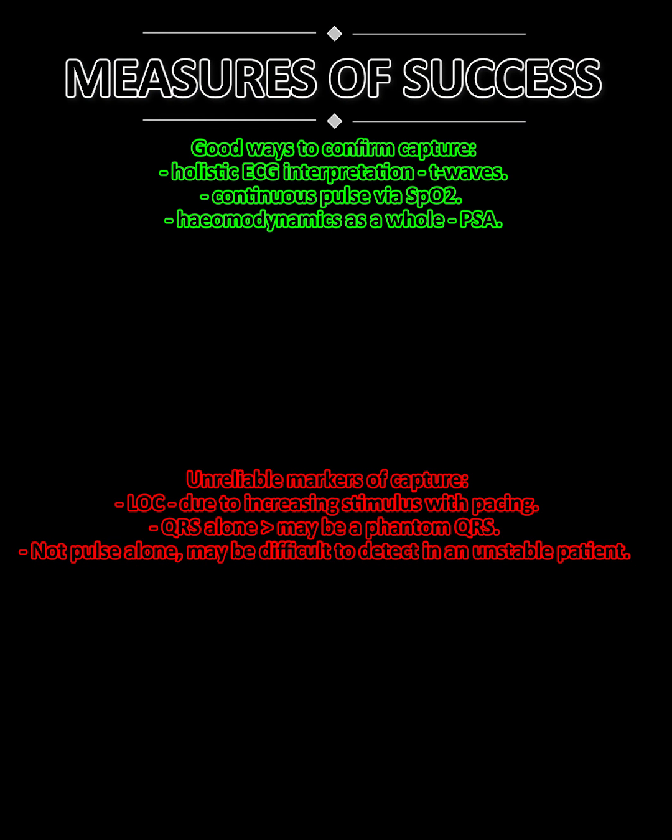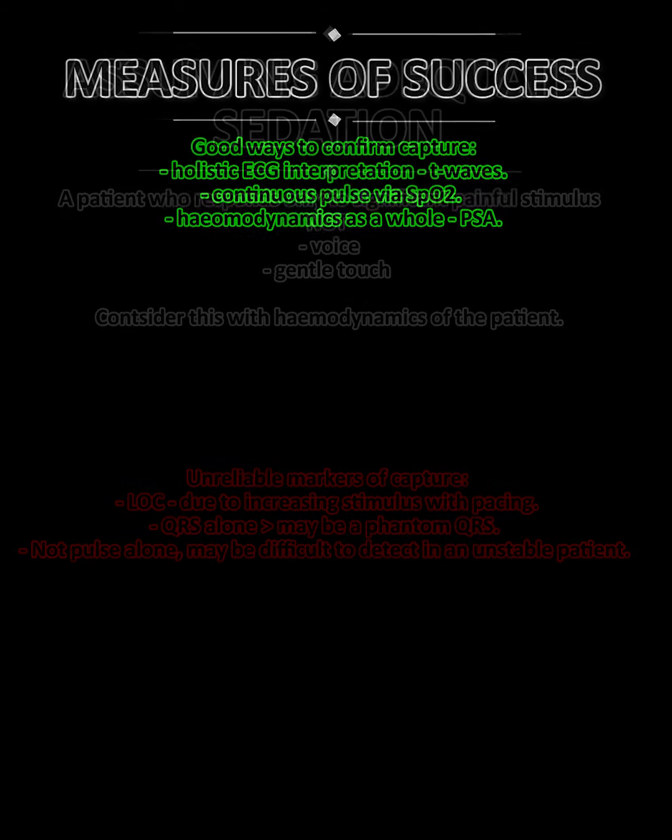To determine a bit further our measures of success, I've included this list. A holistic ECG interpretation, taking account for the T-wave, is very important. A continuous pulse assessment and continuous hemodynamic assessment, including a perfusion status assessment, is crucial. Level of consciousness due to increasing stimulus, QRS due to phantom QRSs, and pulse due to the difficulty in palpating a pulse in an unstable patient can all be misleading.